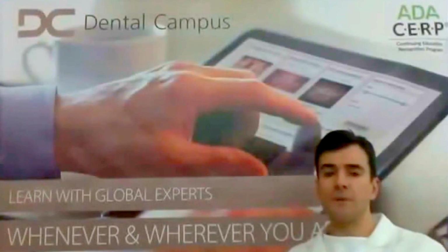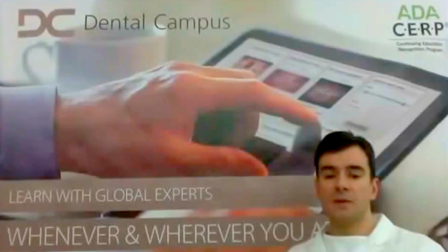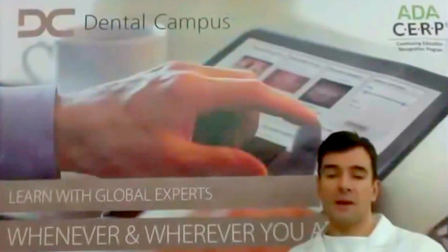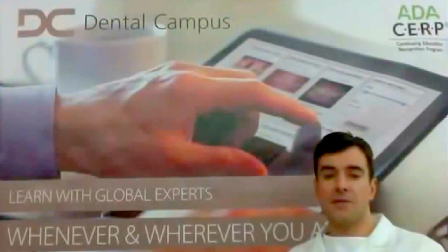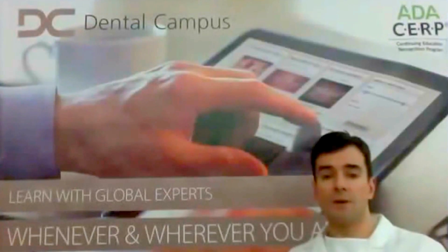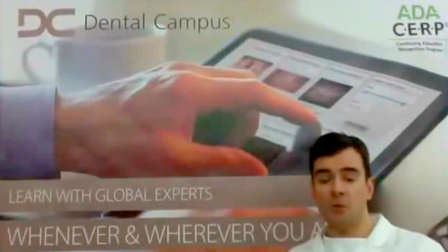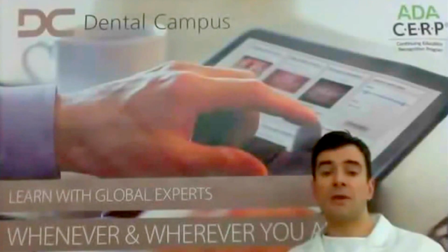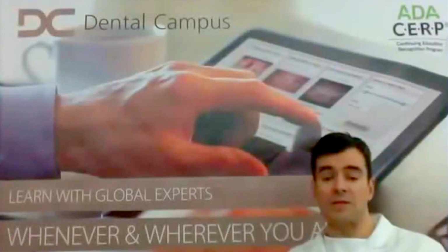However, we know that from the osseointegration point of view, there shouldn't be any problems. This is what we consider in our daily practice. When the patient asks, we explain that there is no problem for the implant, so the implant survival is not compromised. However, we expect the rate of technical complications to be increased.